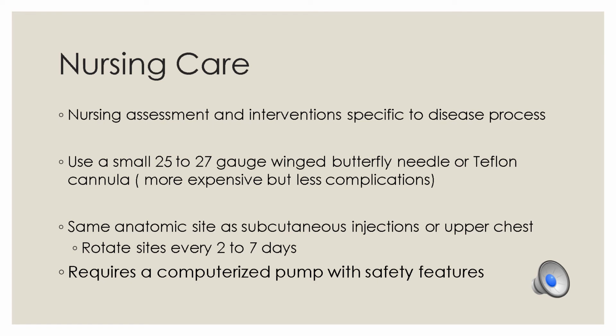As a nurse caring for this, you want to do a nursing assessment and do interventions specific to the disease process. The continuous subcutaneous medication route requires a computerized pump with safety features, including lockout intervals and warning alarms. Ideally, medication pumps are individualized on the basis of the medication being delivered and the patient's needs.